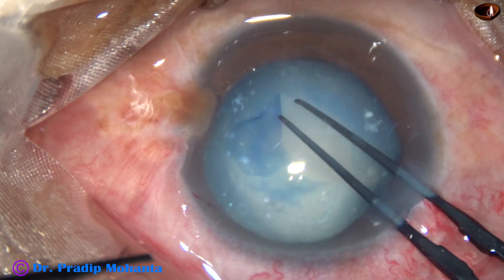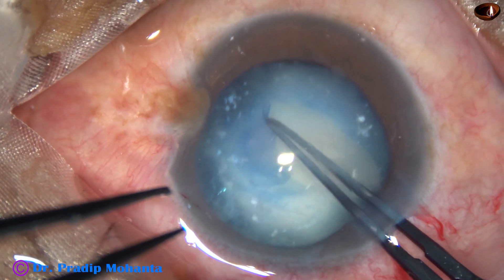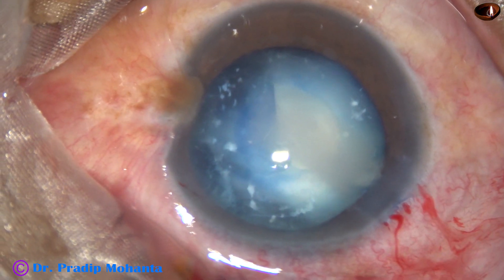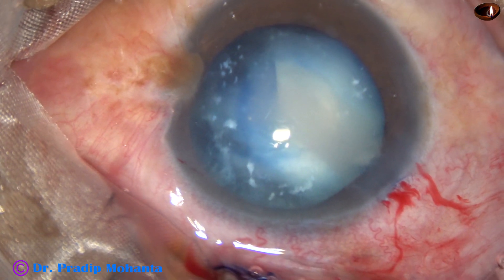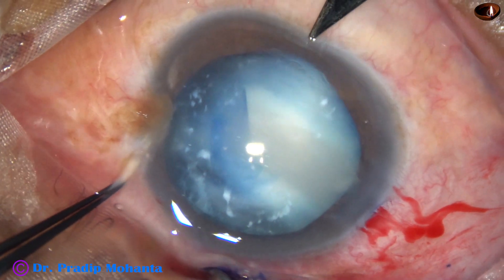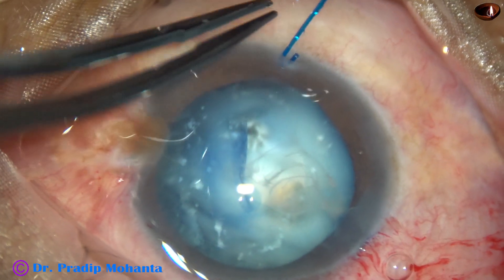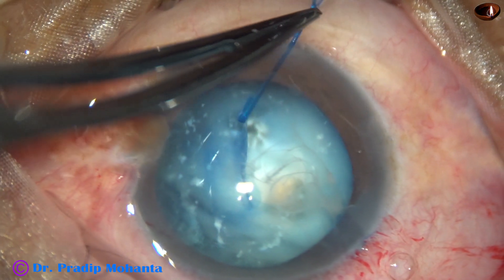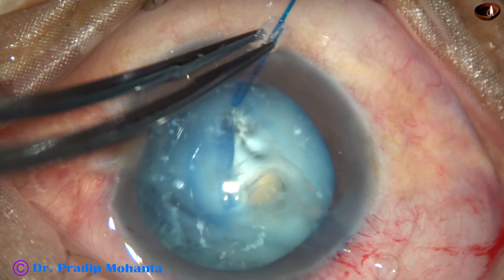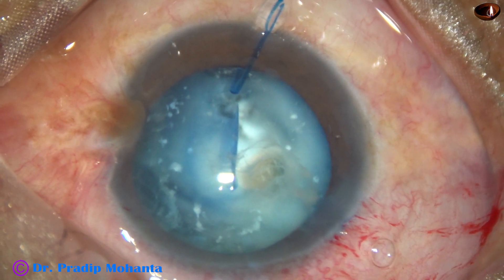The resistance is so much that it tends to cause zonular dialysis. I stop, inject some viscoelastic, and then do a small stab incision at around 7 o'clock. I ask for an iris hook and apply it. It pulls the rhexis margin towards 7 o'clock, and this will offer some counter-resistance — some counter-traction.